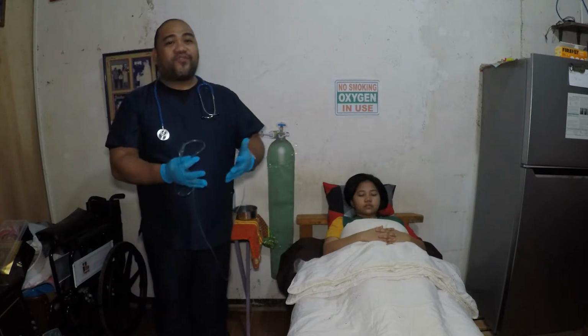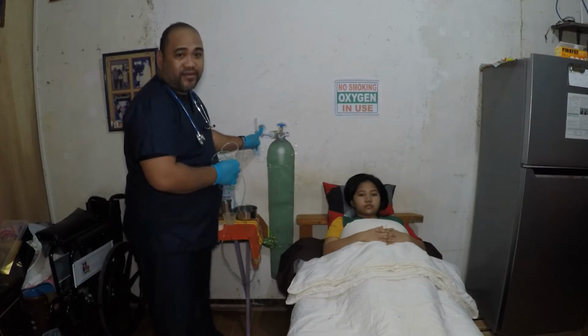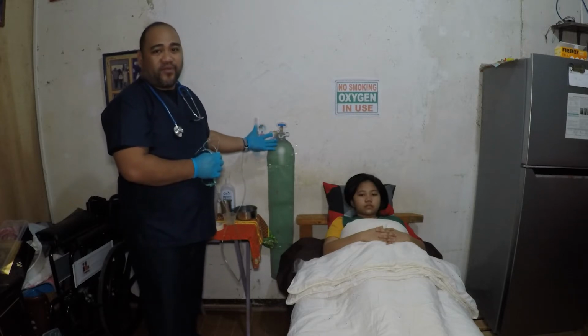Then we have to test flow by setting the flow meter at 2 to 3 liters per minute. This is to provide or prescribe oxygen to the client. So we have to check, open the gauge, and then check also the meter here. Then adjust the flow meter, setting it to the ordered flow rate.